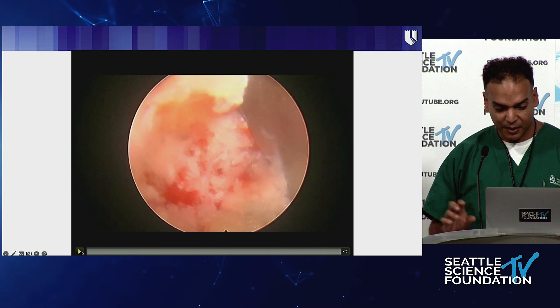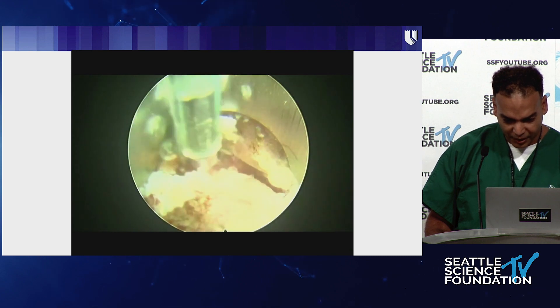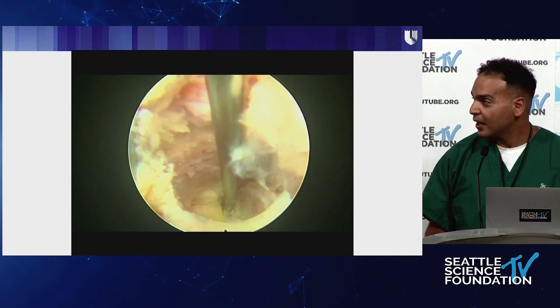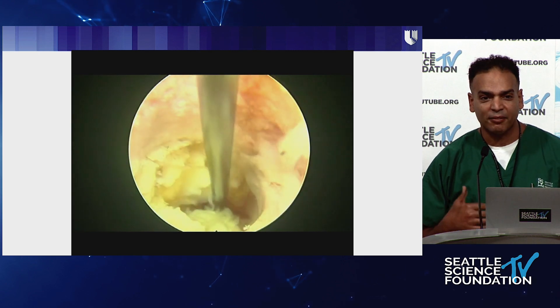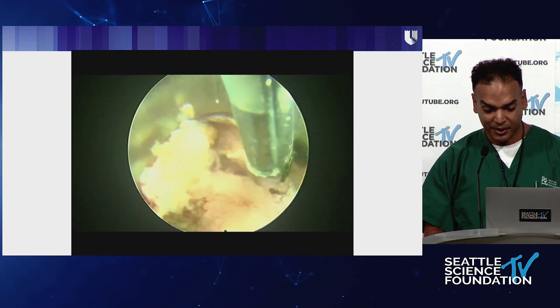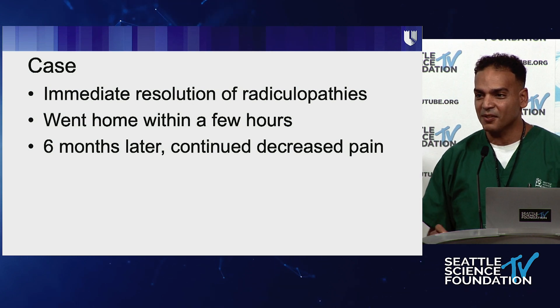At one level the foramen was kind of small so I had to do a foramoplasty — just drilling and clearing soft tissue. Here I'm doing the foramoplasty, making more room; I can see the epidural fat and am opening things up. As I'm opening things up, the patient tells me, 'Doc, my left leg pain is better.' So I know I'm pretty much done — I can open up a little more but don't have to go crazy with the decompression. This was done under local anesthesia only, so as Dr. Telfian said, there's no spinal to wear off — we literally flipped him over and he walked home.